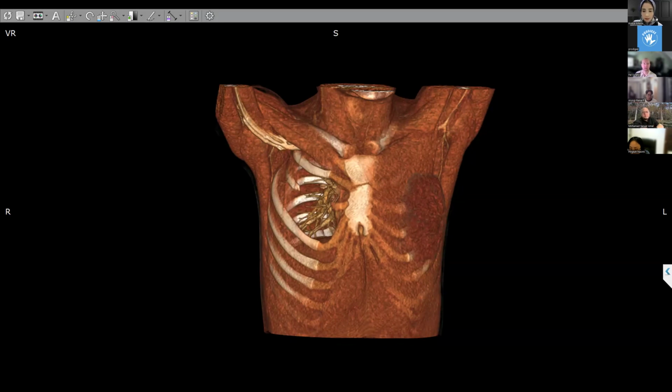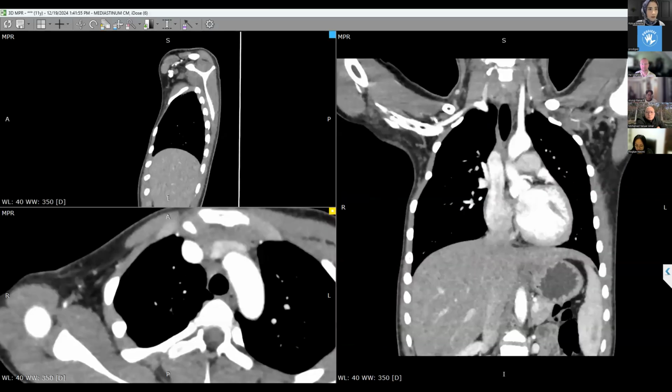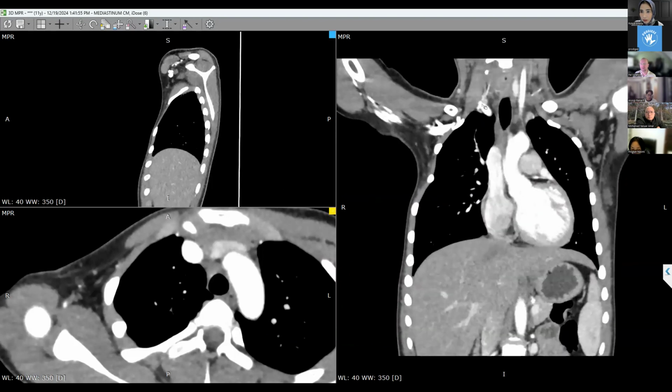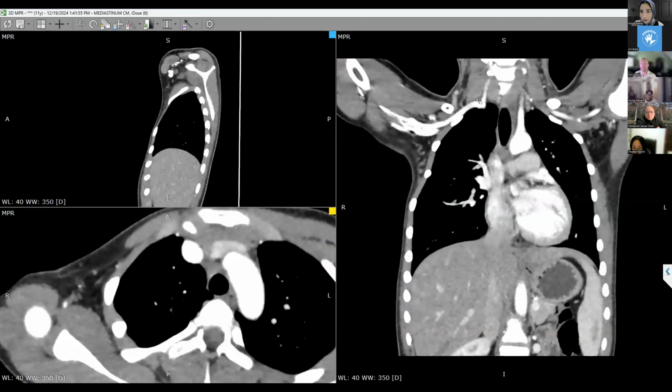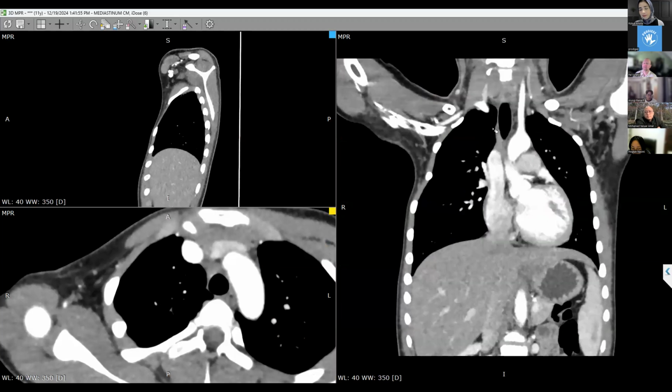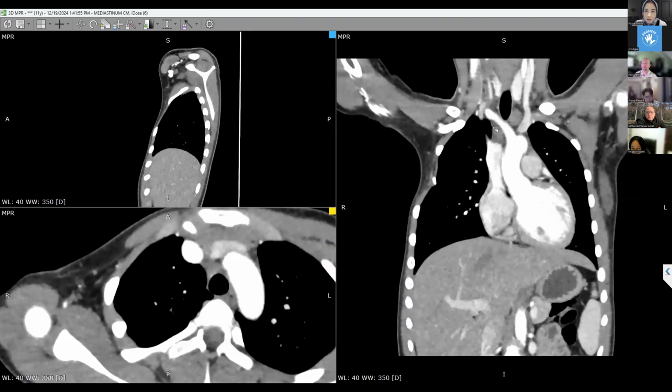Thank you so much. If you could please go back to the MPR, the multiplanar reformats, and follow that subclavian, maybe on the coronal view. That was a little bit too fast for me. I wanted to see that again. Just on the coronal view, to see. So they're all in place. I missed that part. Okay, very cool. And then you can see that hypoplastic rib on that view as well, very nicely.